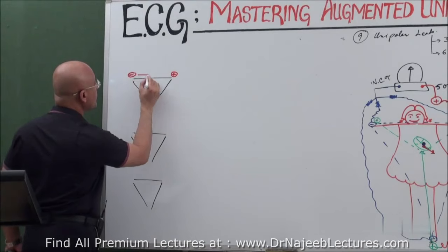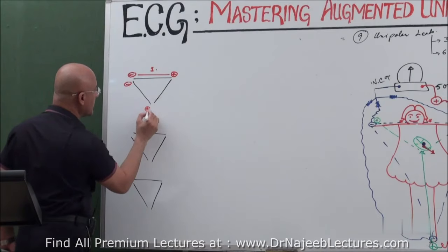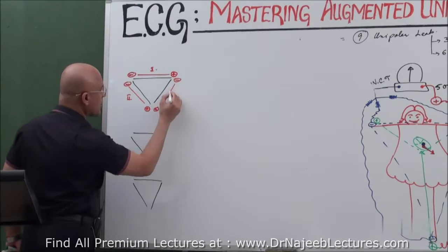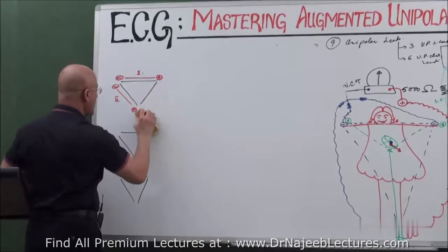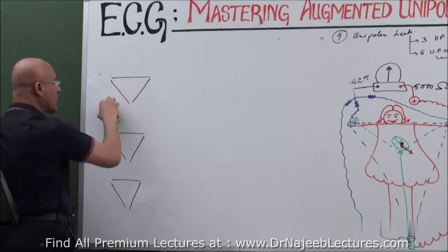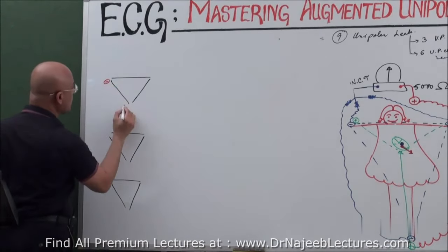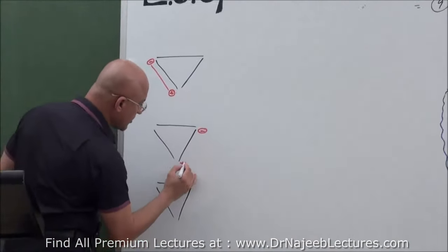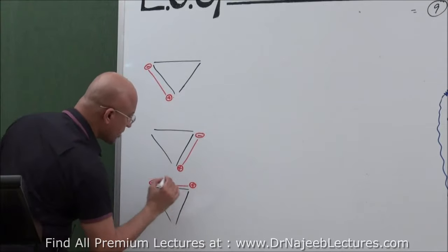What is this lead? Bipolar lead 1. Rapidly, what is this lead? Lead 2, Einthoven's. What is this? Is that right? Clear? Let me put it in another way, and I will compare and contrast it with the unipolar limb leads. What is this? Third bipolar. And what is this? Is it clear? Yes, sir.